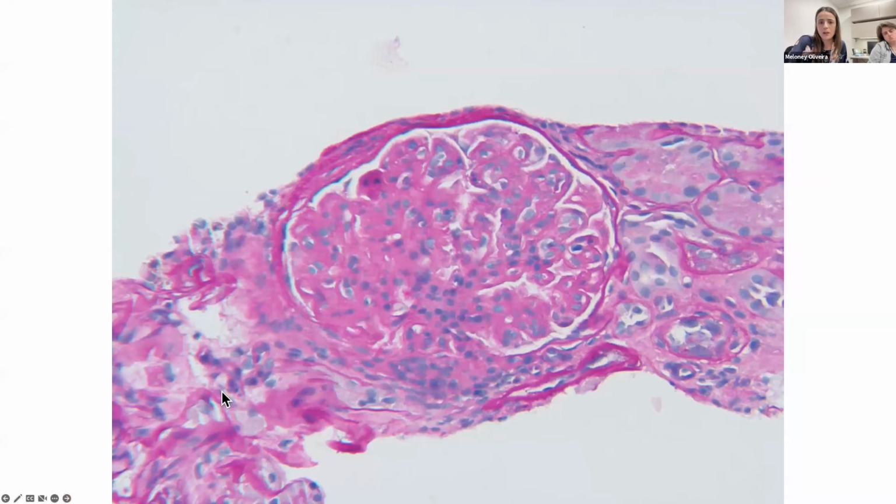Okay, so here we have another high power view of the glomerulus with a PAS stain this time. Here you can really appreciate the mesangial expansion, even with PAS. You can see areas of hypercellularity. Again, at the peripheral areas, the capillary loops look occluded or collapsed. I guess they're not open. I think they're compressed from all that mesangial matrix expansion. At least the Bowman's capsule is intact. And then look at 4 o'clock. What do you think of the capillary wall thickness around there? They're quite thickened. Interesting.